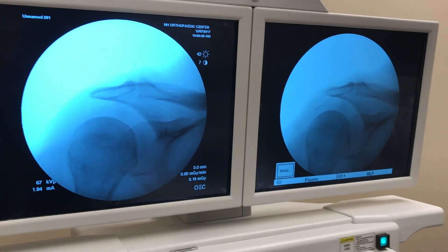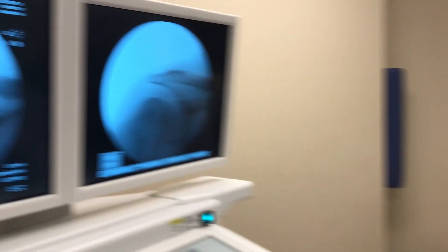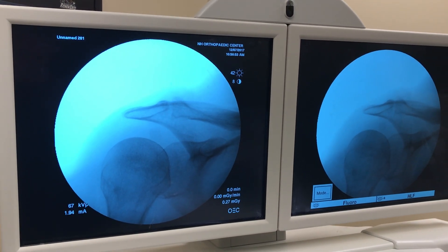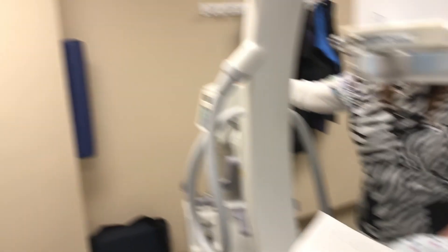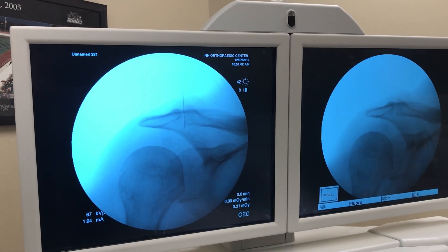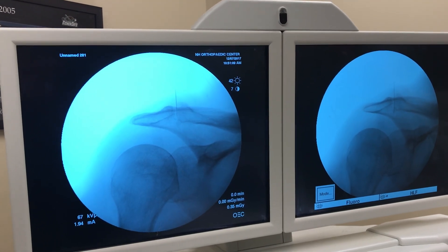If you want to just take a look at the x-ray there — x-ray there — and you can see I'm right down through the AC joint already. So I'll back up just a little bit, x-ray there. And I'm right in the AC joint.